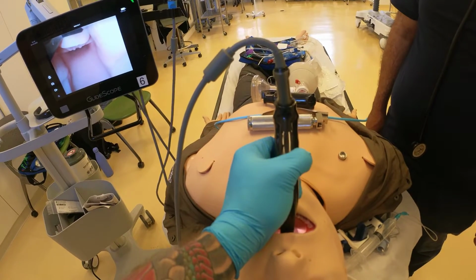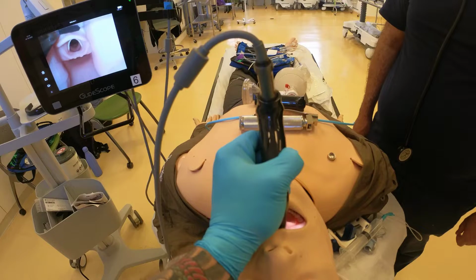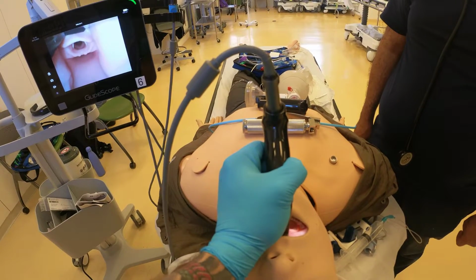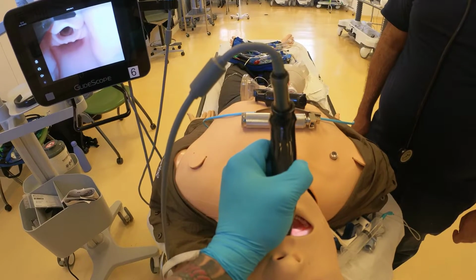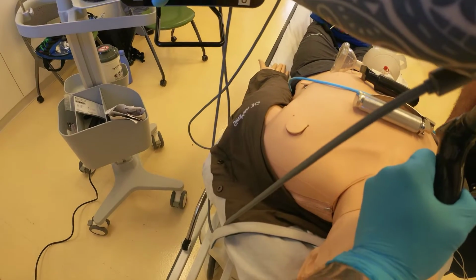Now, very important: you don't want to expose, this is called a 100% view, because if you have a 100% view, you will not be able to advance your endotracheal tube. You actually want a 50% view. So what I'm saying is a 50% view of the tracheal inlet. So these are your true vocal cords, and I want a 50% view.